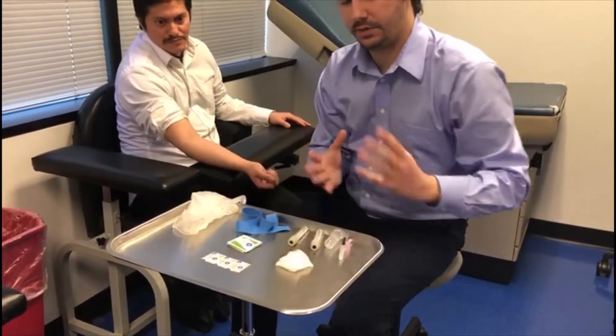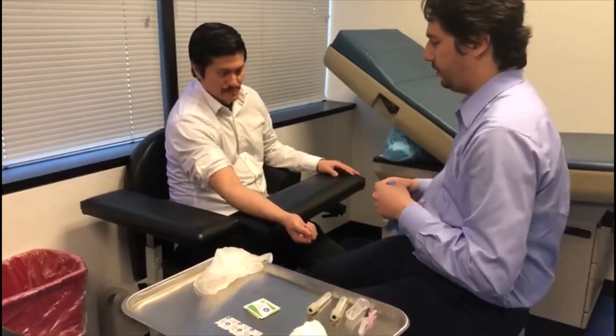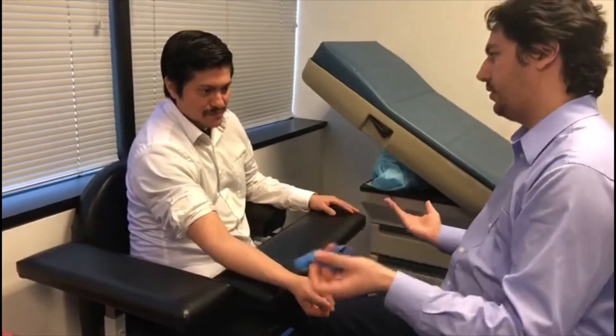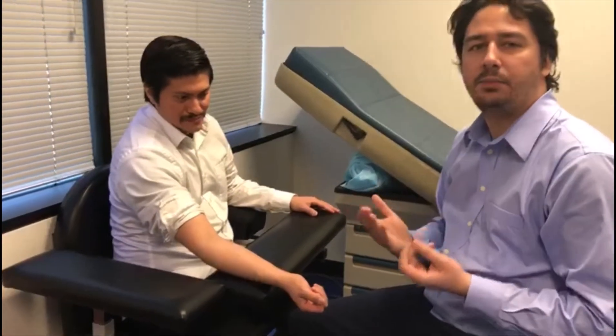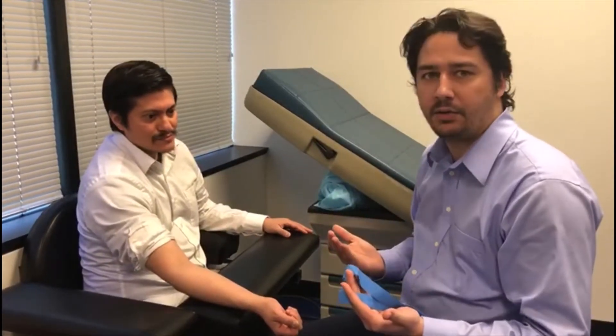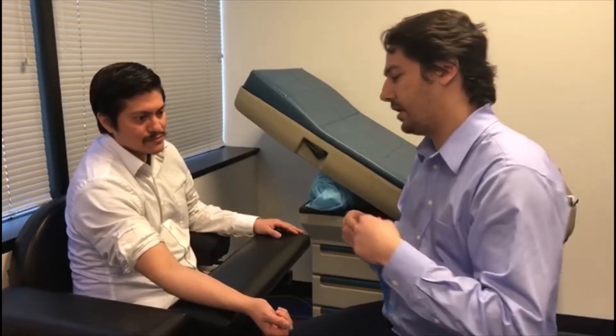If you see, it's already starting to look better. After we get that sorted, he already knows what's going on — blood work being done. At any point in time he can refuse this, and this goes for out in the field as well. If your patient refuses, just try to figure out why.